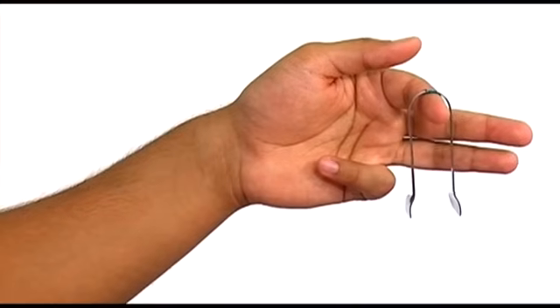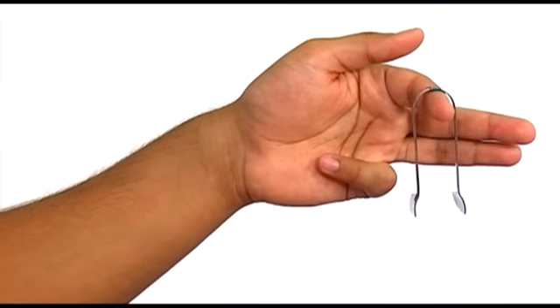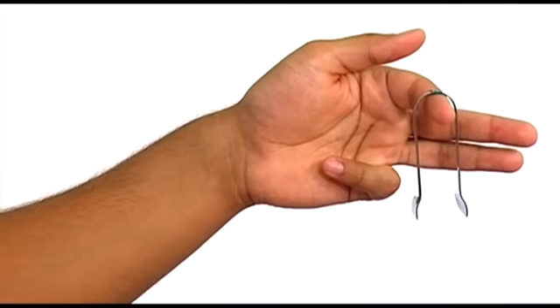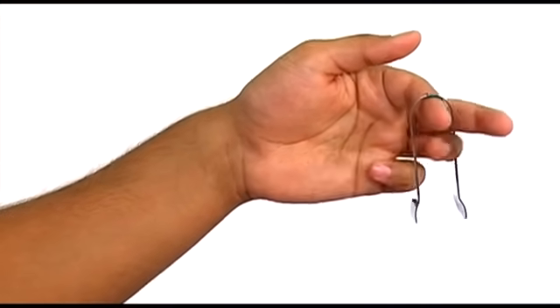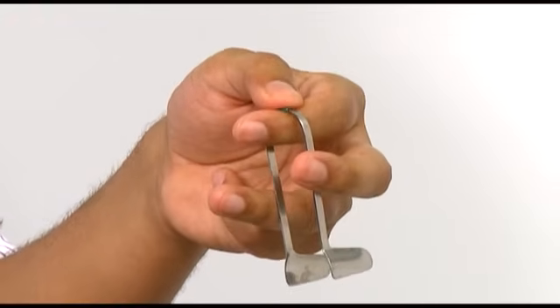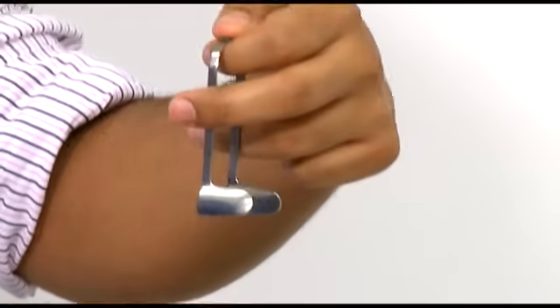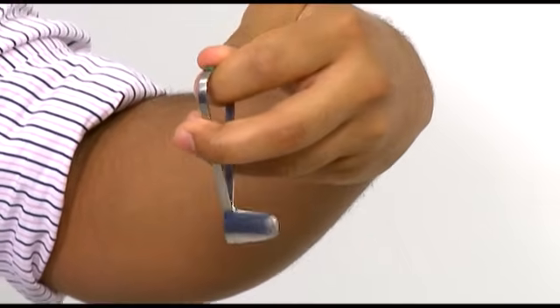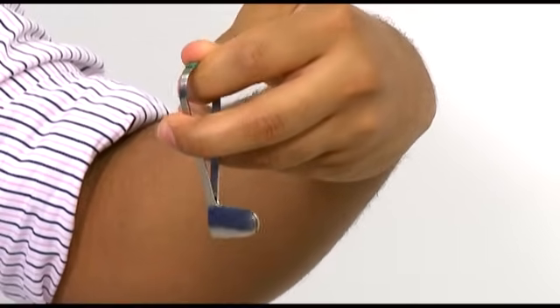In the next part of the examination, we'll use a thudicum speculum to examine the nose. This is held from the tip of the index finger of the left hand, with the middle finger in the front and the ring finger behind, and the thumb pressed firmly on top to support. The hand is then twisted, and pressure is used between the middle and ring fingers to open and close the speculum.